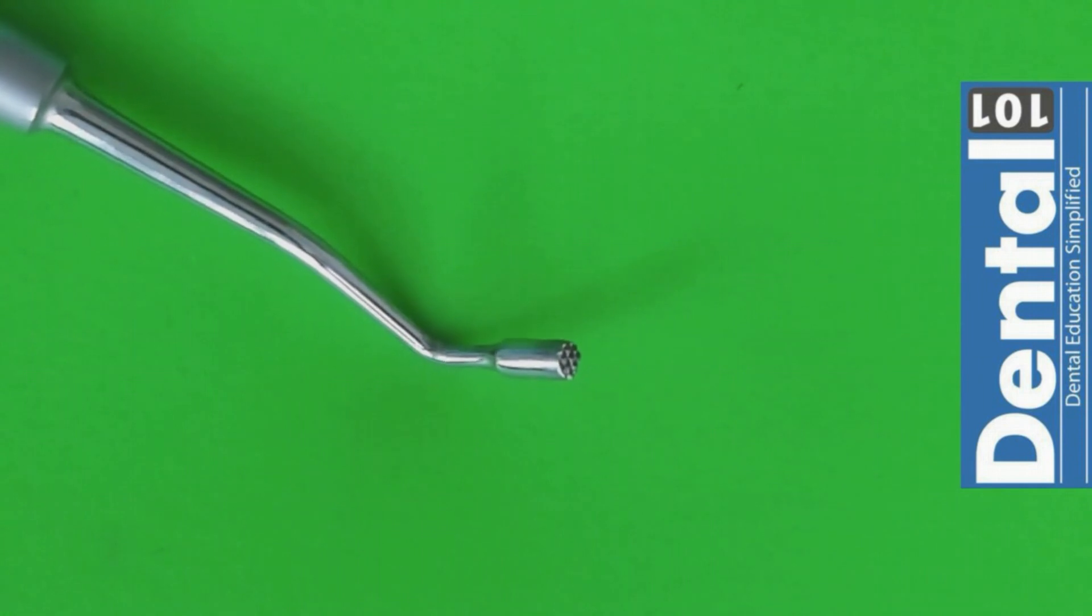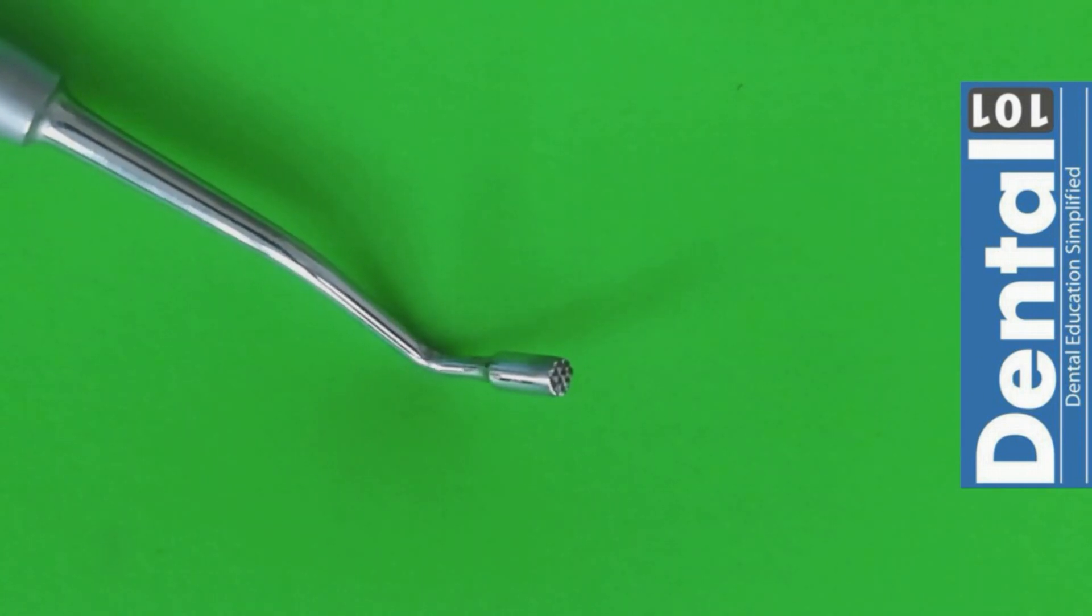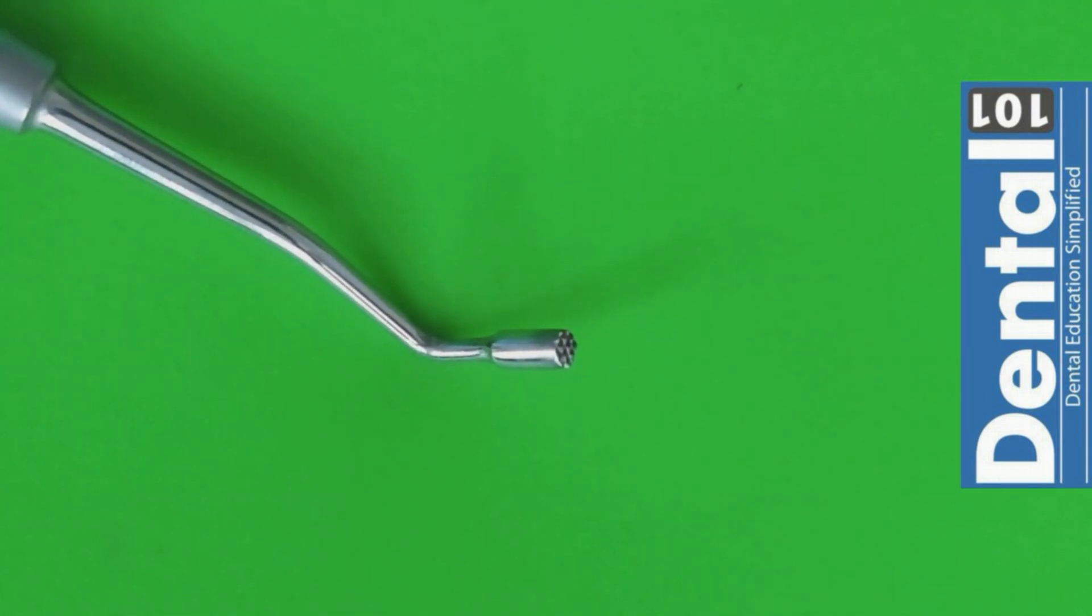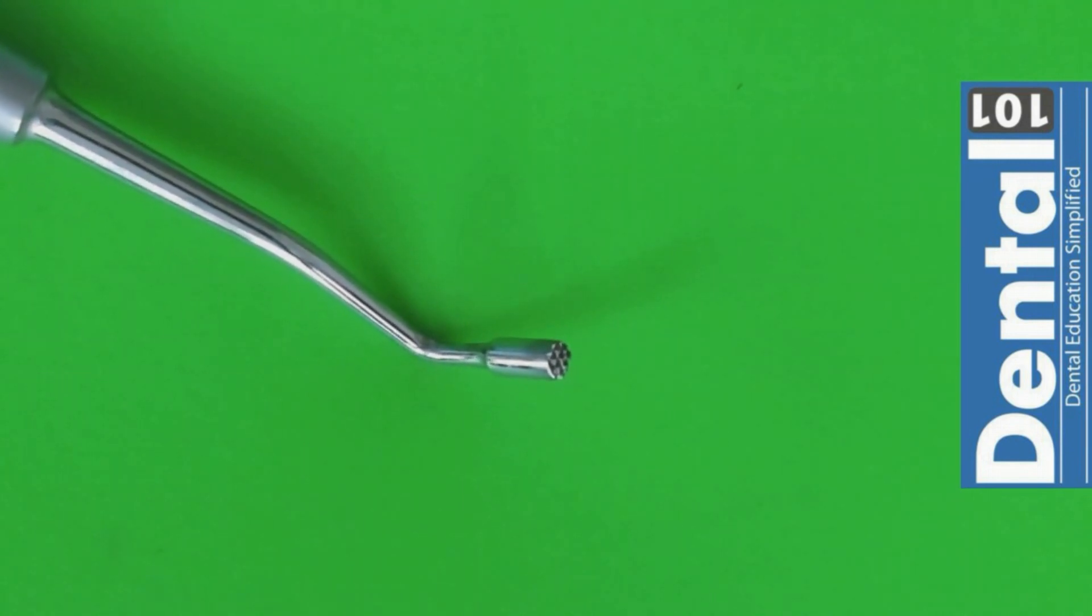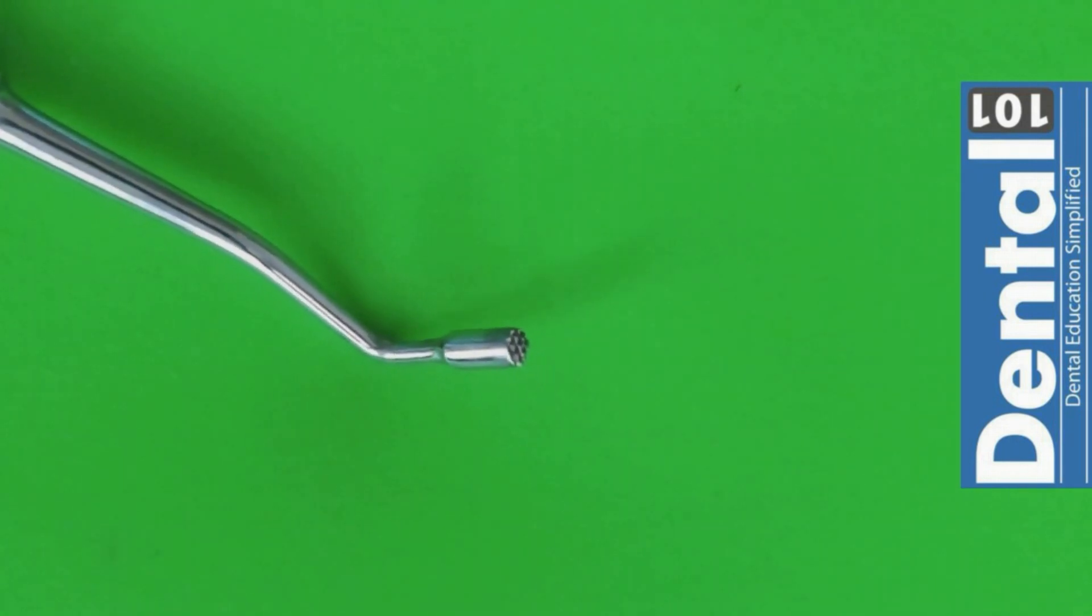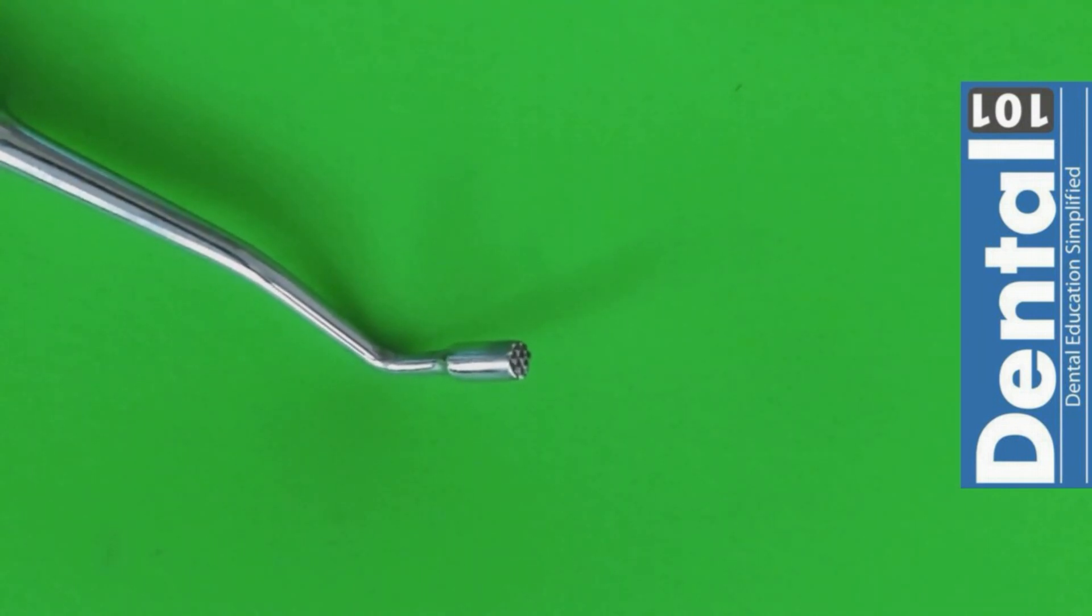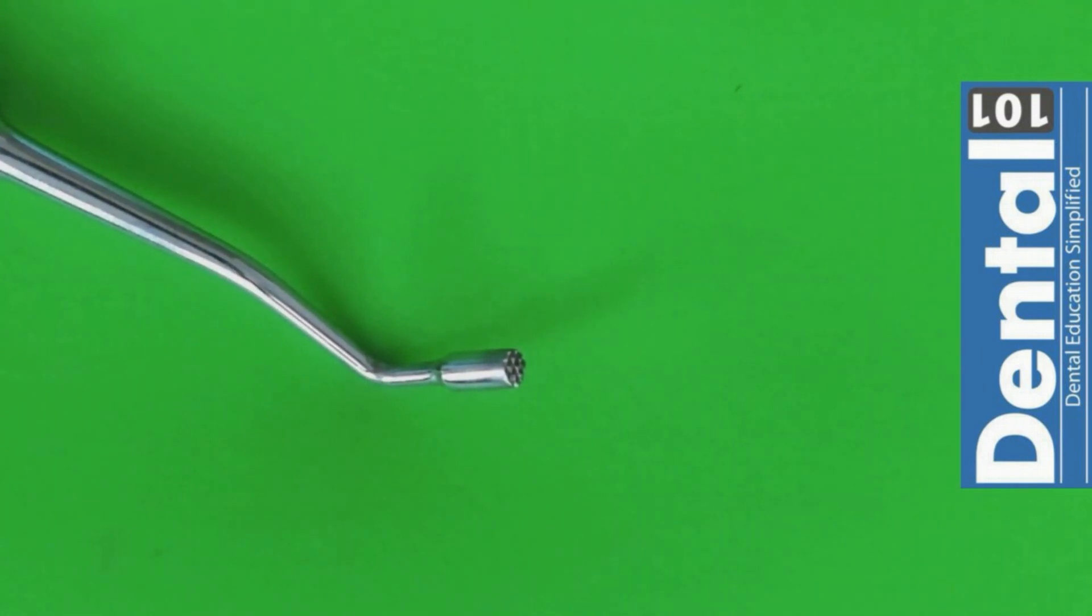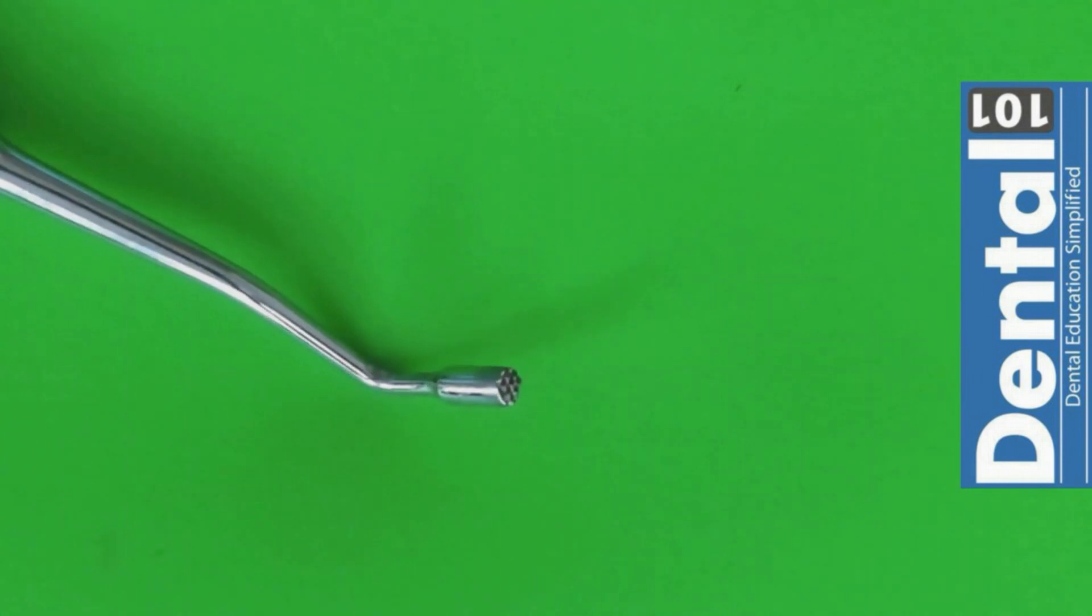Here we have the condenser amalgam or the amalgam plugger. This one is just specifically for amalgams, unlike the Martenson plugger that you can use for composites and amalgams as well. This one is just for metallic fillings such as amalgam. As you can see, the working end has this little grid pattern that is going to help you condense your amalgam quite well.